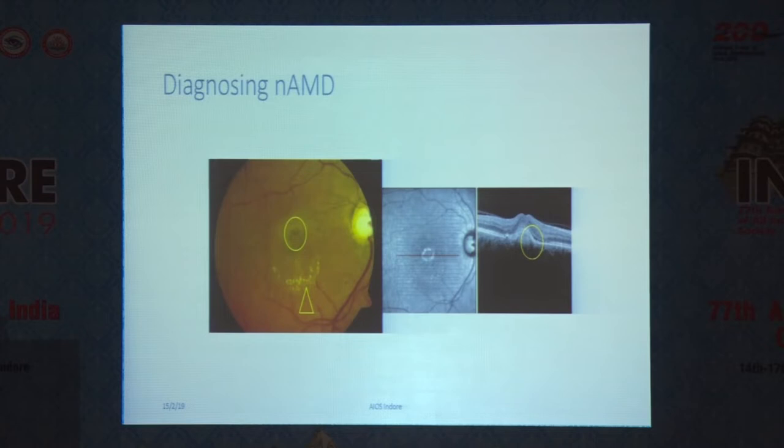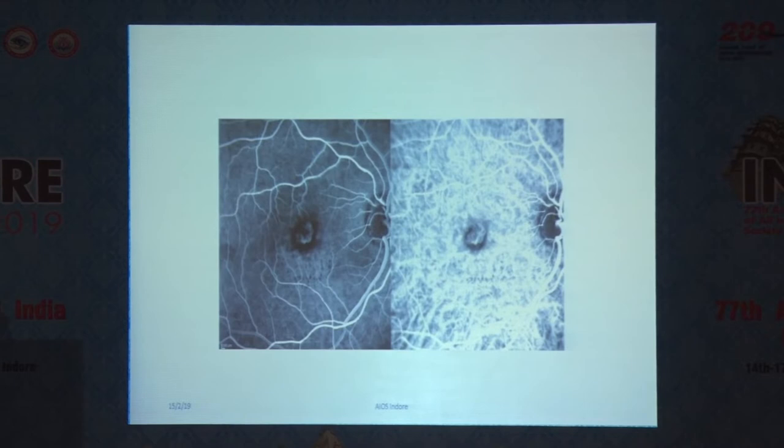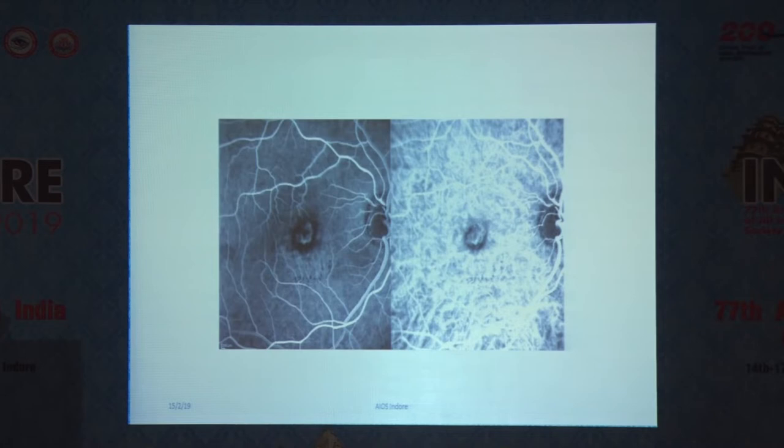You look for what is called SHREM, or subretinal hyperreflective material, pigment epithelial detachments, and so on. In the UK, it's standard practice to have a baseline fluorescein angiogram that would confirm the presence or absence of your choroidal neovascular membrane. We tend to use both fluorescein and ICG angiography together because it gives us more details about the choroidal circulation, in particular for cases with IPCV.